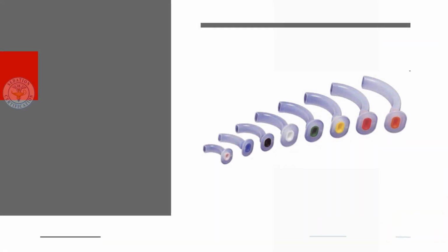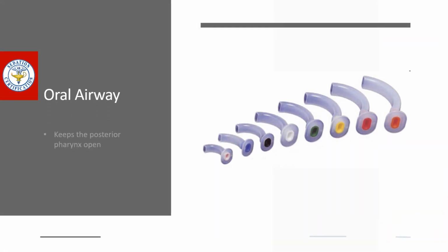Put too much and they're laying there and it starts dripping back, and what's it going to fall on? Vocal cords. Now they're paralyzed. All right. And then here's what our oral airways look like. They come in a lot of different sizes.